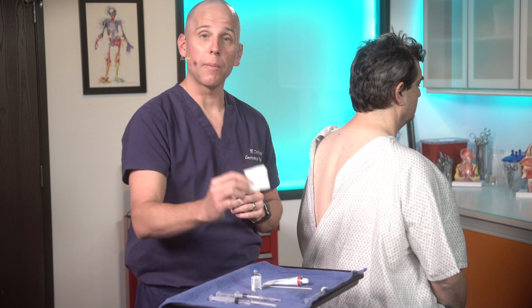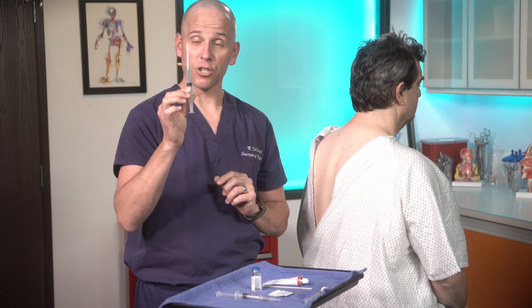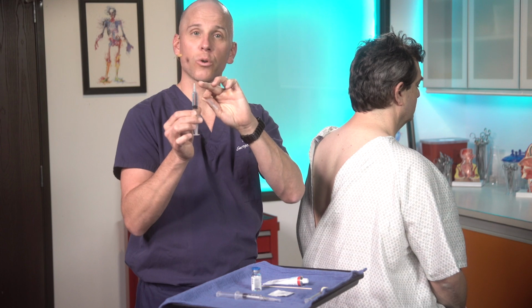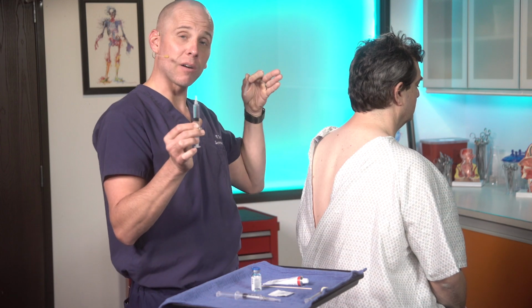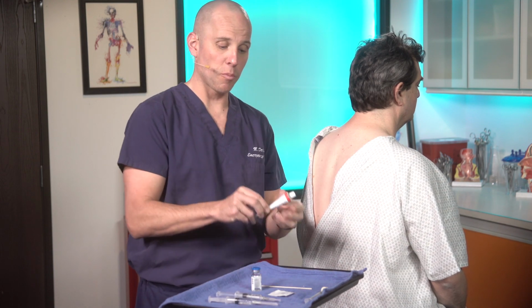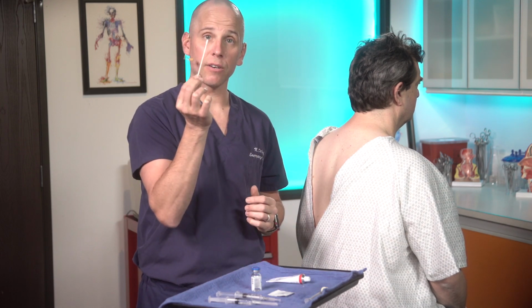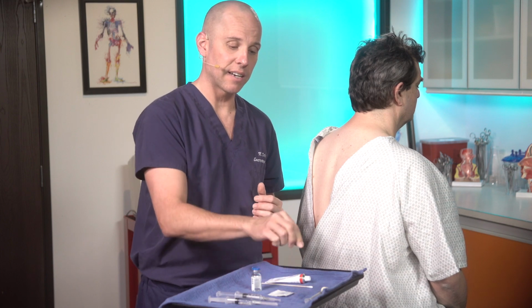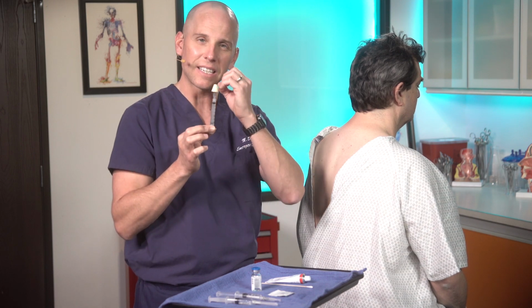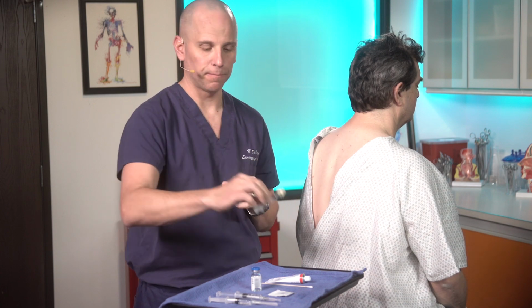I'll have an alcohol swab so I can do a little local prep where I put my needle. I'll have my syringe with my anesthetic. This is a 27 gauge long needle, so it's about 1¼ inches. I like that length because it helps me with my paracervical and occipital nerve blocks. I will also have my 4% viscous lidocaine, a cotton tip applicator for our sphenopalatine block with that viscous lidocaine. And here I've added an atomizer, and I'll show you what I'm going to use this for. I use this to do a little anesthesia in the nare before I do my sphenopalatine block.